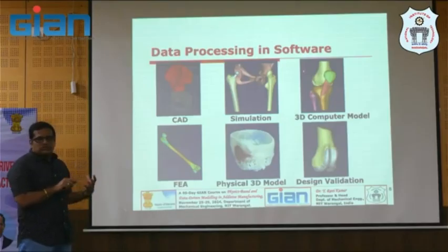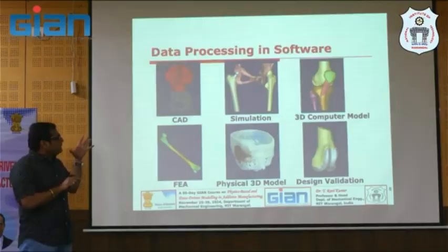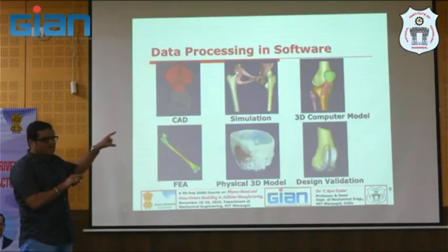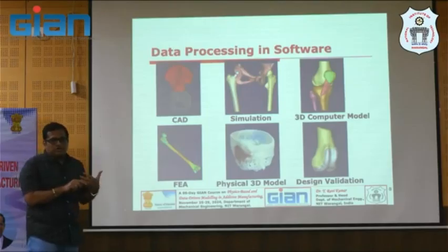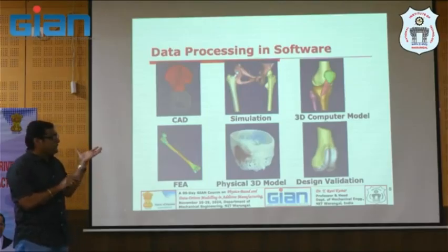and simulation. So you design one implant, say you have a femoral joint here. You have a pelvic joint and you have the femur bone here, and this is the joint here. Somebody has met with an accident or some kind of trauma, so he broke his joint, for example, and then you are trying to design a customized implant here. You have designed it by scanning the patient data. And before printing it, or before he or she goes to operate, we need to check the fitment of this joint, right? So then you can do a lot of simulation in these kinds of tools.